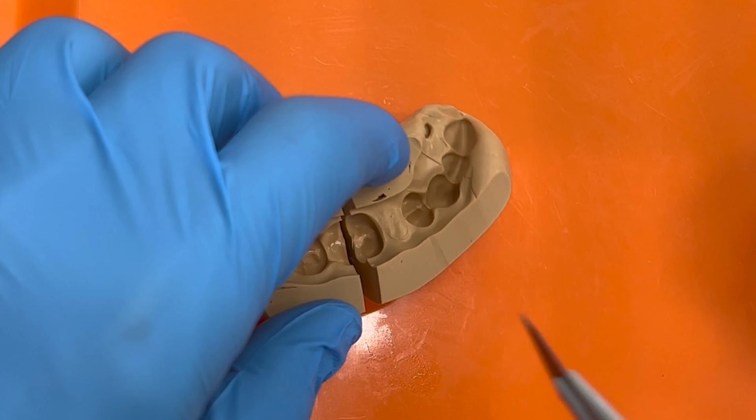Then, I prep the mesial part, keeping the burr straight. The burr I'm using is already tapered, so it's going to give me the required taper. Remember, the molar is already angulated distally, and I want to make it straight, in order to have a common path of insertion, or draw, with the premolar.